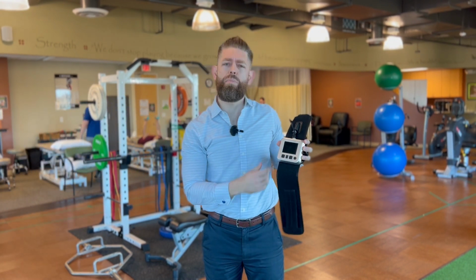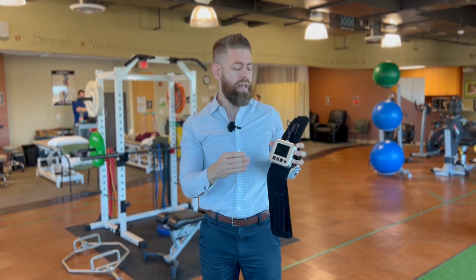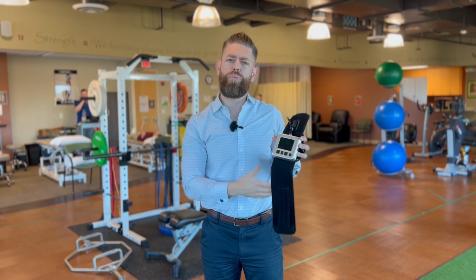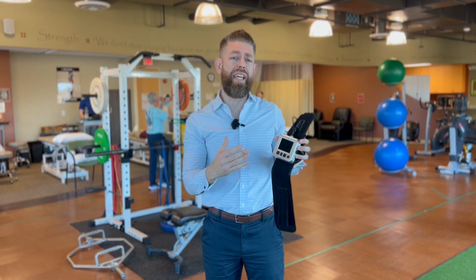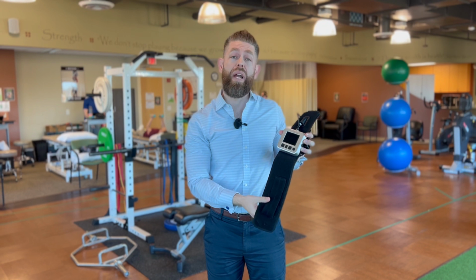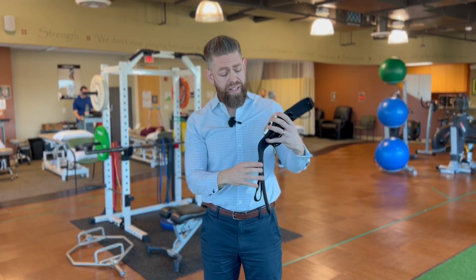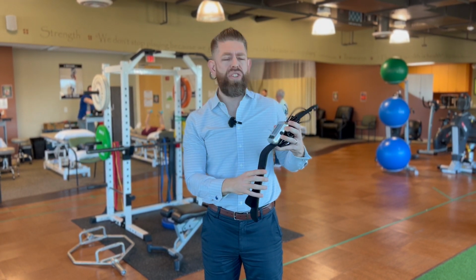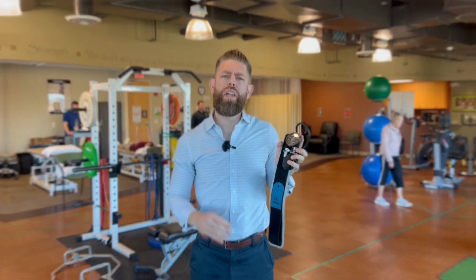The first one is called Smart Cuffs Pro. It digitally calibrates specific to the patient's limb, which gives us extra precision to calibrate limb occlusion pressure. That can be really useful because it allows us to restrict blood flow to a point where we can get extra fatigue at low loads. This can be great for tissue that can't tolerate high loads early in rehab. The potential negative is it's a single bladder air system, which does mean it gets super tight and can be uncomfortable for patients.